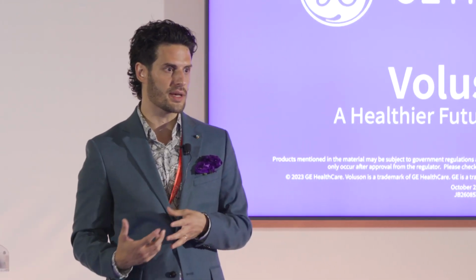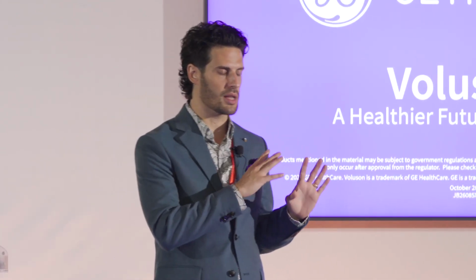Yeah, absolutely. I think we are at a very pivotal moment here where we can understand how endometriosis changes with time by looking over and over again. There are some limitations to that. We're not perfect. You might not see something on a scan today and then you look again in 3 months and it might have been there, but you just didn't see it. So I think we have to be very careful to say things are progressing or regressing because the imaging, particularly for superficial endometriosis, is not perfect.